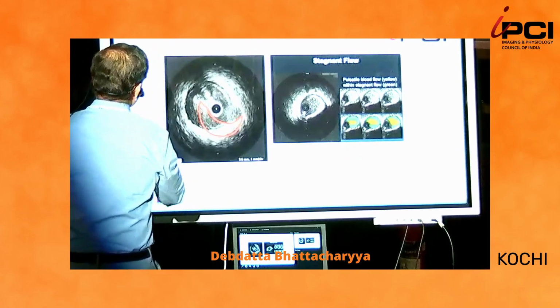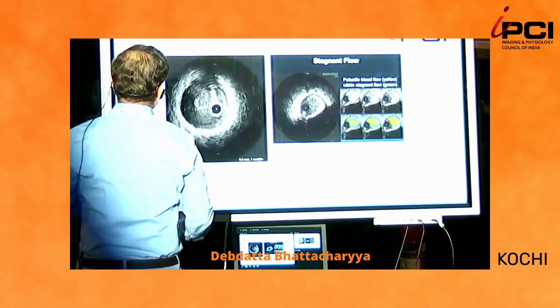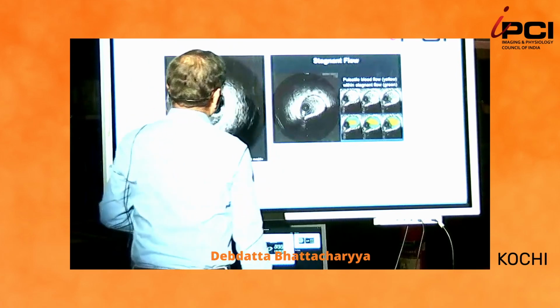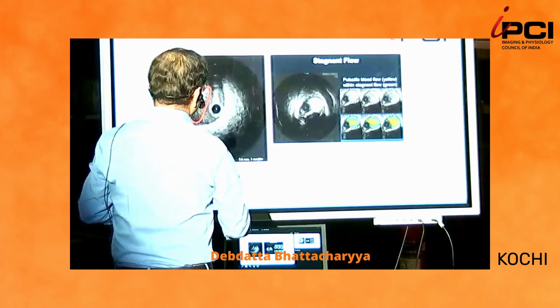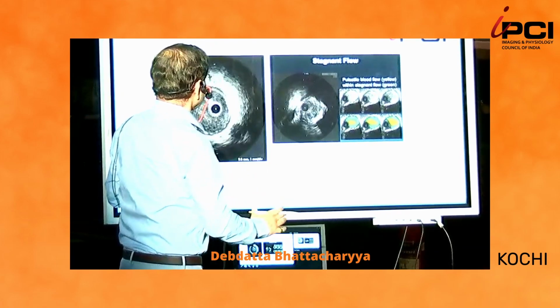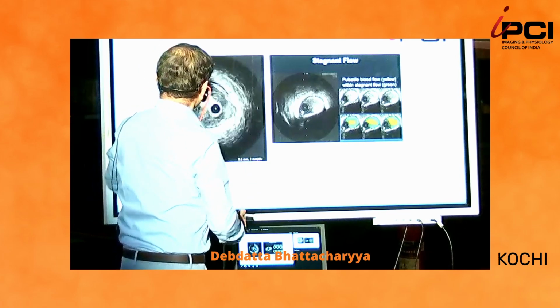And this is thrombus and stasis. So I showed you a picture of thrombus. There was the thrombus. But here, this is actually the catheter has gone through a very tight stenosis, and you cannot see the flow, the lumen as well as you should see. And this is not thrombus, this is stasis.